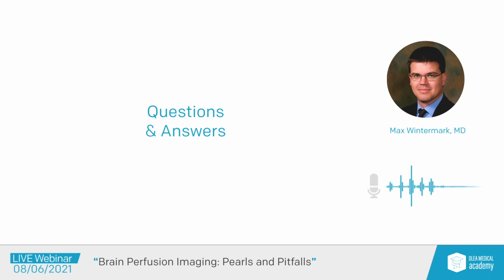You can cover the whole brain, and as a result, you are sure you are not going to miss the infarct if it's not in a large territory infarct in the typical location. So there are definitely advantages to that. Now, again, not everybody has one of those volumetric CT scanners, and sometimes you have a scanner that has a smaller coverage. In that case, you have different options.